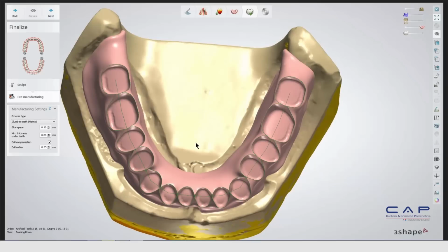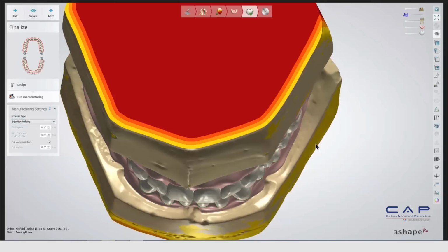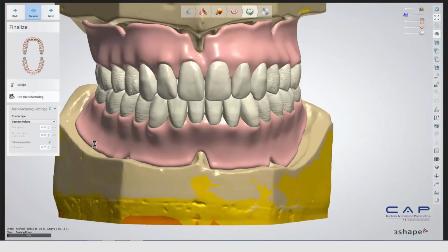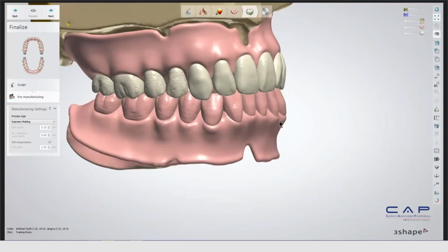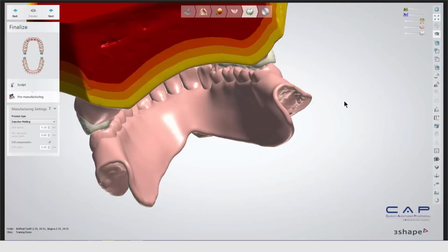That's exactly it. Or we can choose it back to the injection molding, which goes back to the instance that Bob was talking about at the beginning of the slideshow, where you print these both as one solid object. So the base and the teeth are printed as one. And then you just add that acrylic or pink wax onto the interiors to give it a little more aesthetic features when trying it in. Now it's converting the file to a single one. Rather than having two files, we now have one on the lower. So the lower is now all one file, ready to put in the printer.